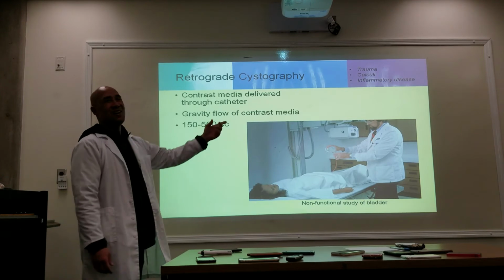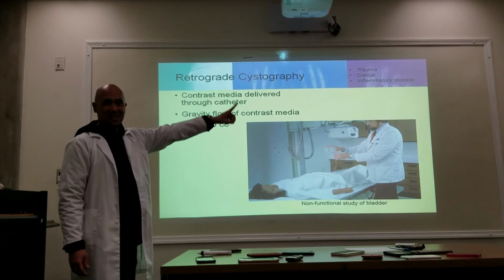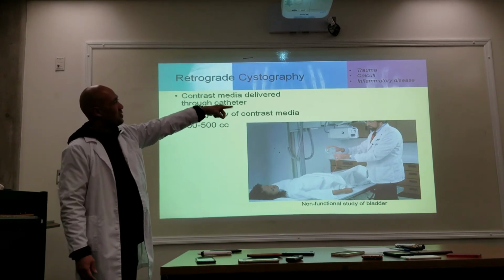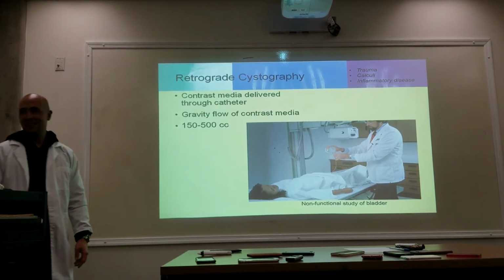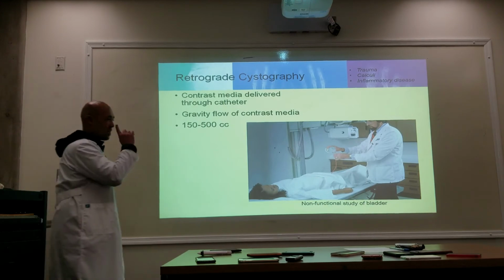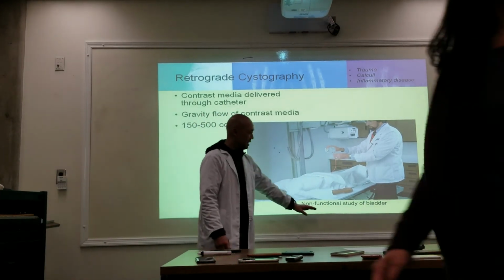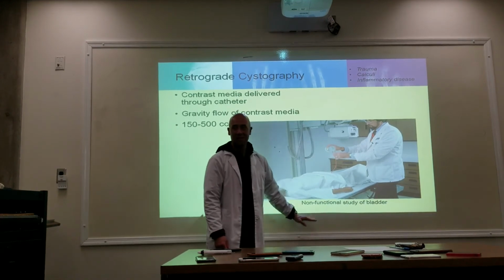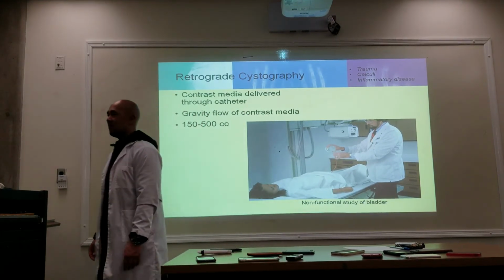Okay. So you're doing a retrograde cystogram. We're doing it for trauma, stones, and also inflammatory disease. Okay. Here is the key importance. It is also a non-functional study. Okay. The cystogram is a non-functional study.